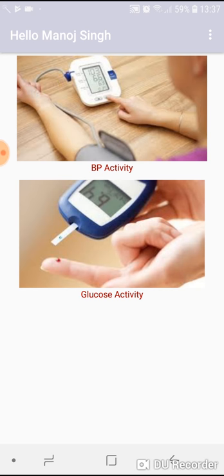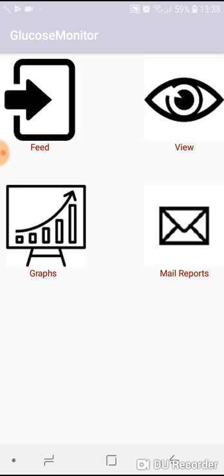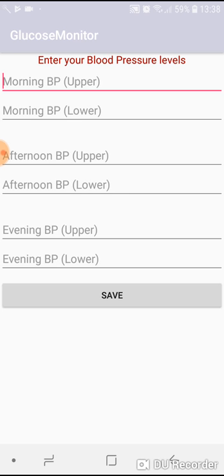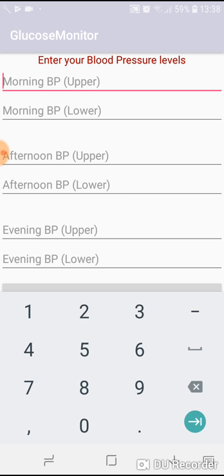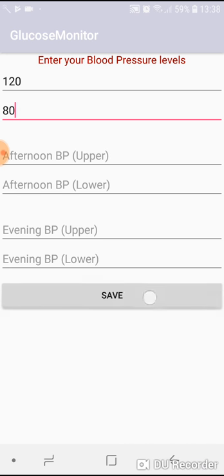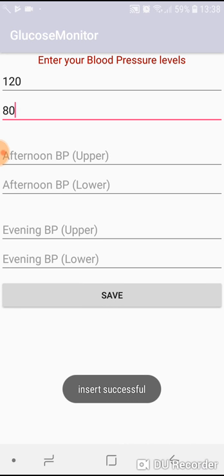There's one more activity - BP activity. You press it. Again this is very similar to the previous one. You have to feed. This time there are upper values and lower values. For example, in the morning the BP was 120 by 80. Just save it.